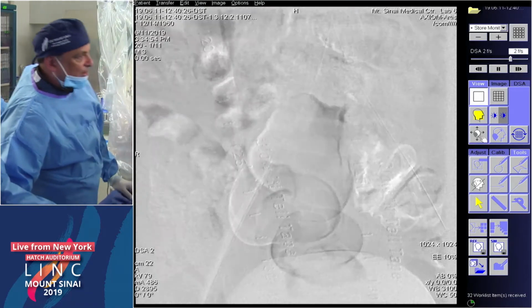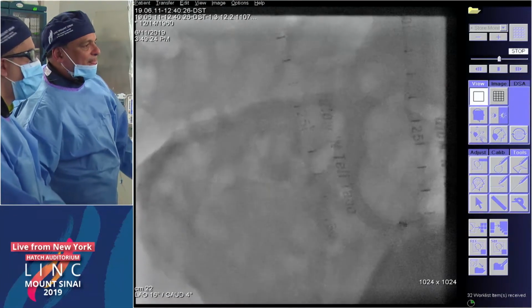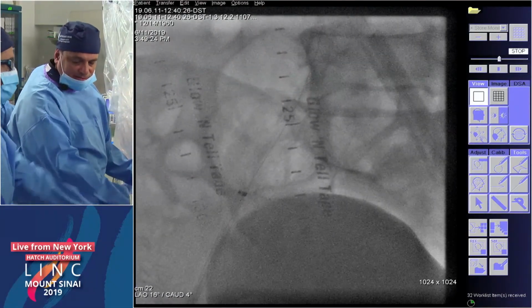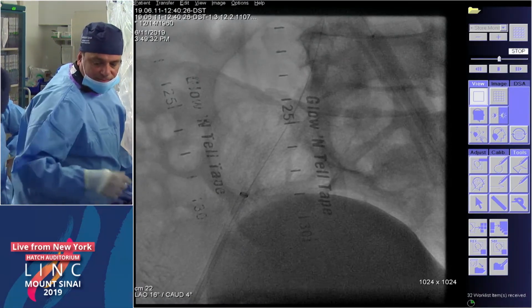And now I'm going to do what you want me to do, Jen, which is show you the iliac shot, which will show you whether we're at the level of the bifurcation or not. Ready, Cine guys on this side? On this side, right? Yeah, one side. Inject, please.